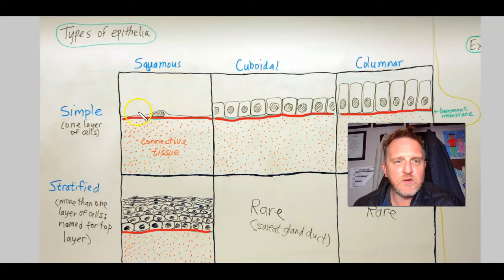And so if you have a look at this one, this squamous cell, it's flattened, almost like a raw egg, and that would be the yolk analogy there. And then the albumin on either side. Albumin, what am I saying? The white of the egg. So you would have your yolk over here, and then the white on either side.